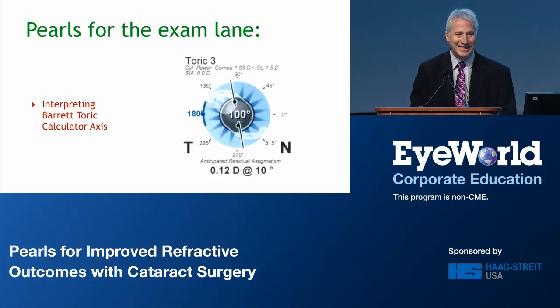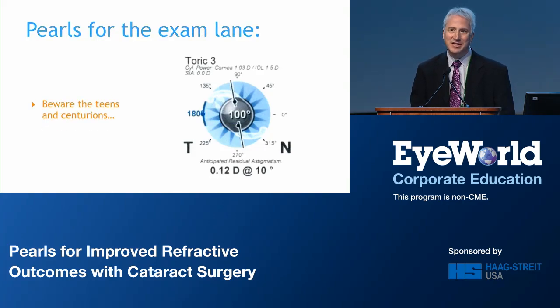There's a couple other things I want to call your attention to, and these are from mistakes that I have made. Yes, indeed. So if we look at this, this is what I like to call beware of the teens and the centurions, okay? So look at this. We've got an axis of 100 degrees, and there's a little bit left over at 10 degrees. 110 looks pretty similar. That's a flip, right? So there's 100 degrees and 10 degrees.